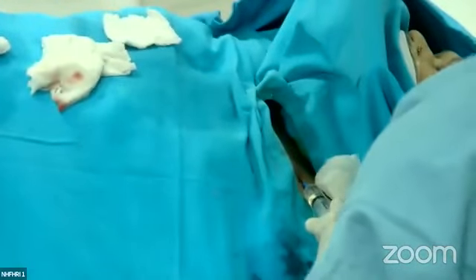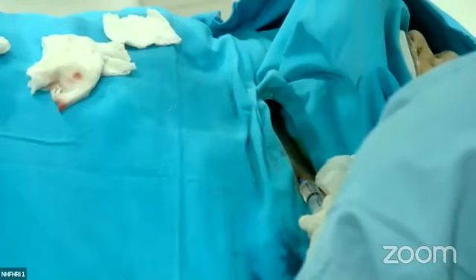Clavicular notch, just below the clavicle. So I am going from here. Please focus on the patient.